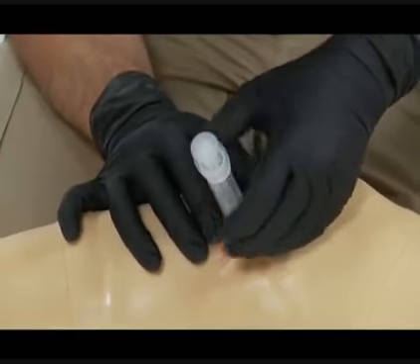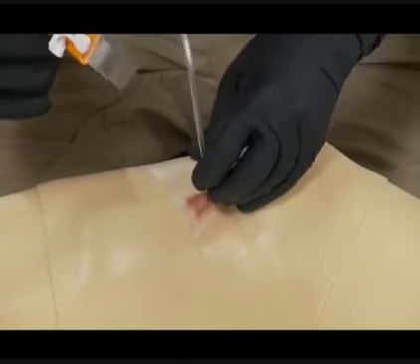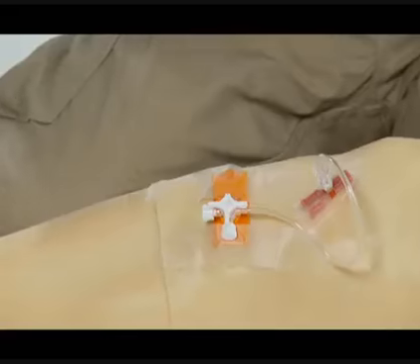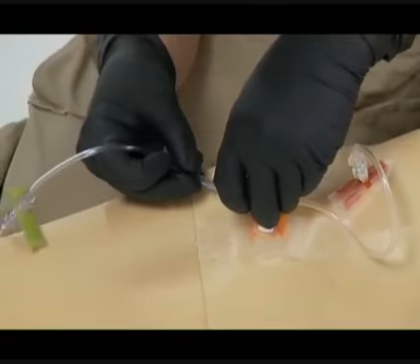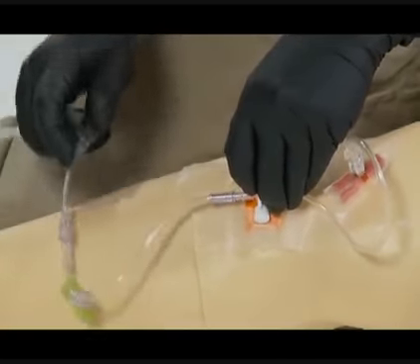Bone marrow can now be aspirated into a syringe for laboratory sampling. However, do note that a lack of bone marrow does not mean the I/O is improperly placed. Connect a stopcock or an extension set to the cannula. Flush 20 to 30 cc's of saline before injecting fluids or drugs.